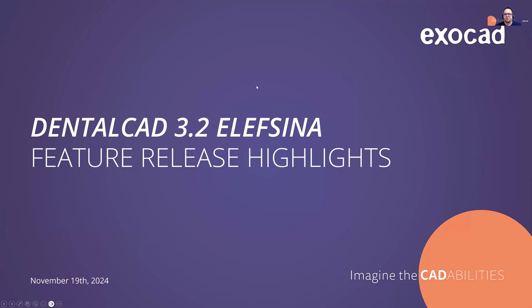Before we get started with the live demonstration, we have a brief PowerPoint presentation here just to discuss some of the latest features of DentalCAD 3.2 Elefsina for our latest feature release. So we'll proceed here with the highlights.